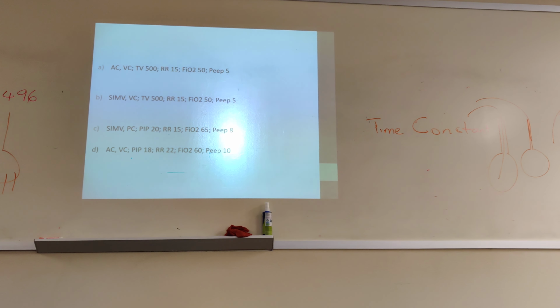All right, so this next one here, SIMV-PC now, pressure of 20, respiratory rate of 15, FiO2 65, that's too high. And then the last one there, we have PEEP of 10.